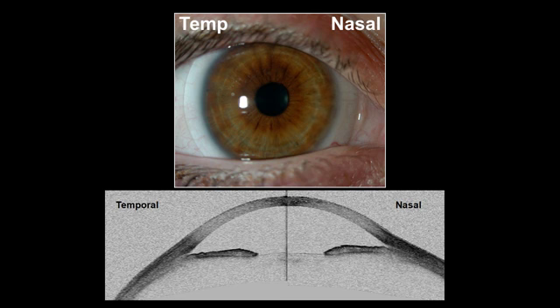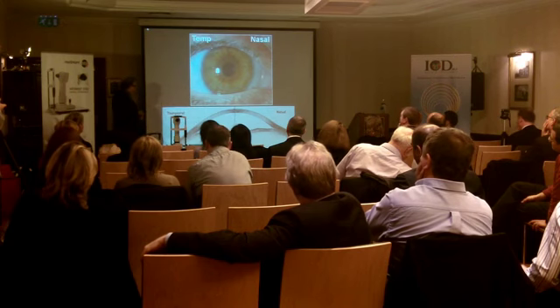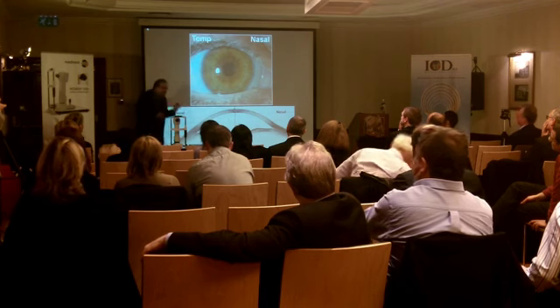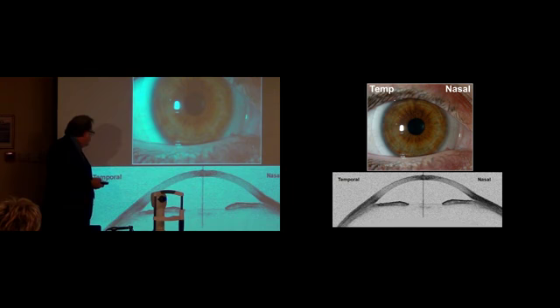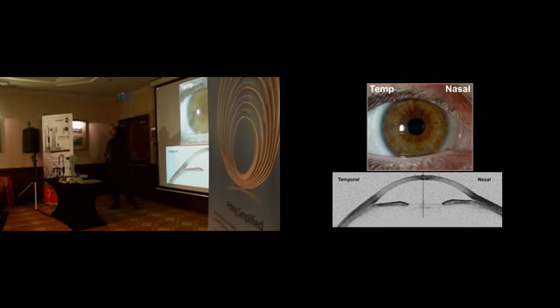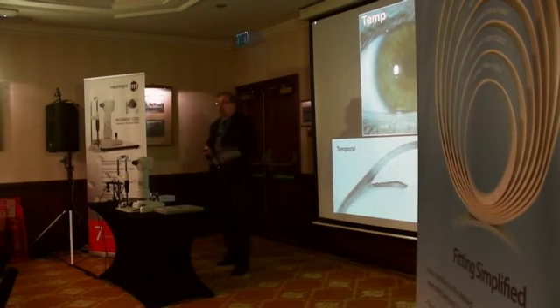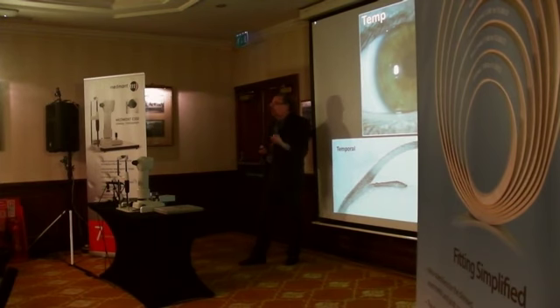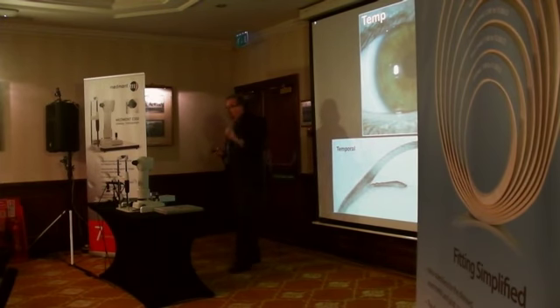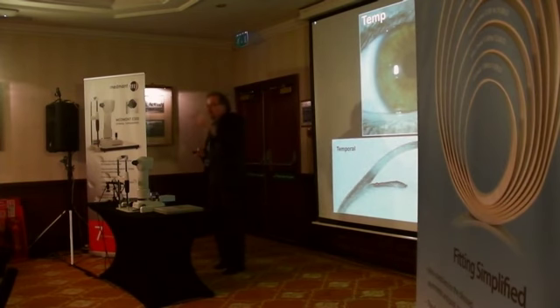Now I said I would mention a little tiny bit about some exciting work we're doing at the university, and that is in measuring the height of the sclera, both nasal and temporal, superior, inferior. Now I'll just cut to the chase. What we have found in our preliminary studies is that the superior and inferior sclera are very similar in their height.